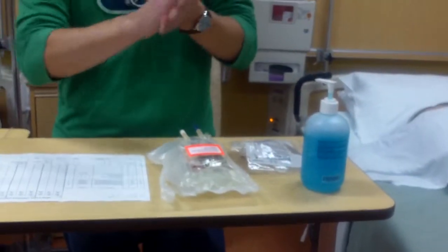My name is Jacob, and this is going to be my changing of the mainline IV bag and also a piggyback. So the first thing I'm going to do is check my patient's chart, notice any allergies on that chart, and know that I have to change the bag as well as administer medication of gentamicin. So I have my MAR, I go to the med cart, do a little hand hygiene here.